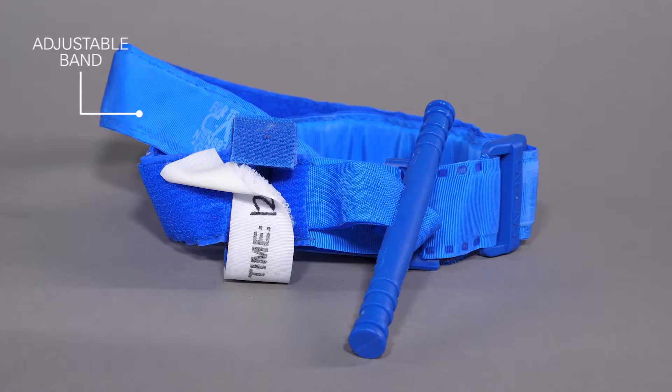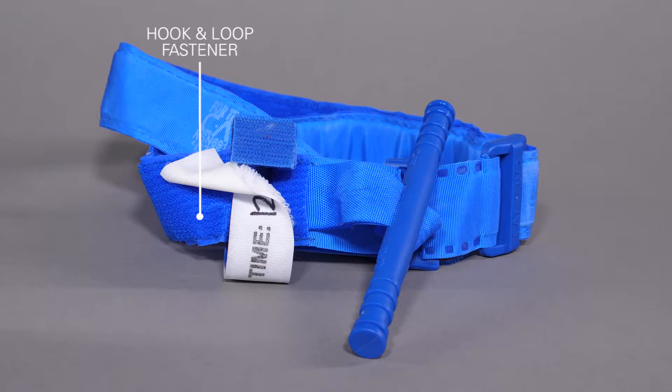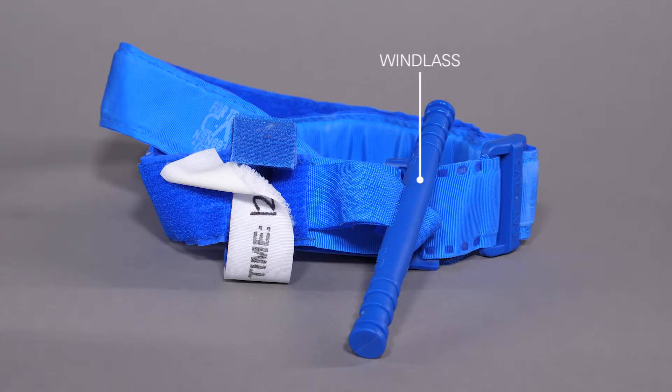The combat application tourniquet consists of the following components: the adjustable band; the hook and loop fastener, used to hold the initial placement of the band; the windlass, a small rod used to further tighten and lock the band in place; and the time strap, used to secure the windlass and record the time the CAT was applied to the limb.